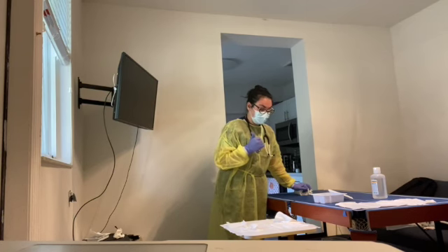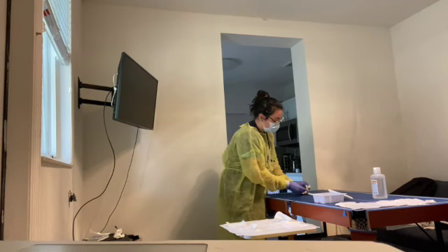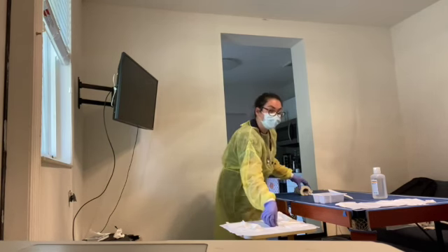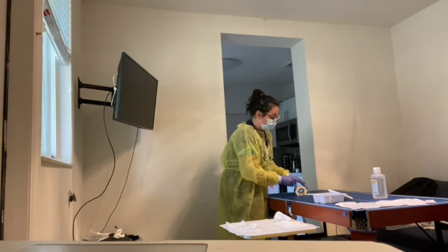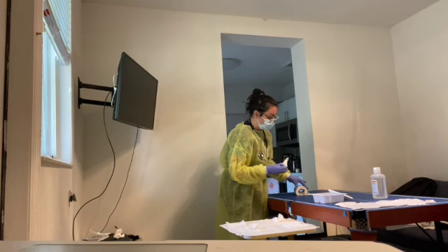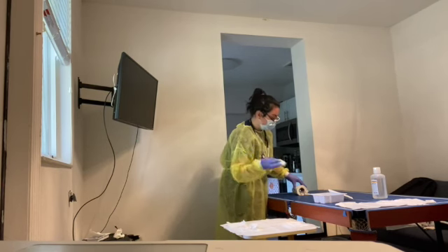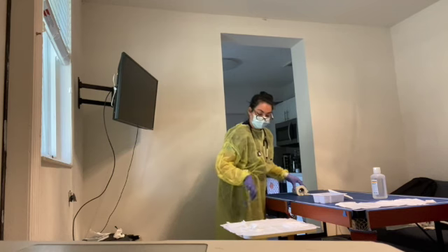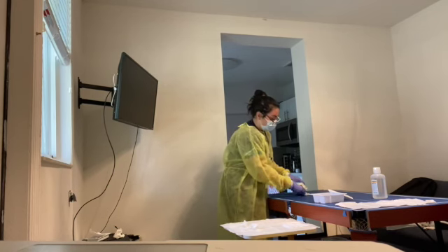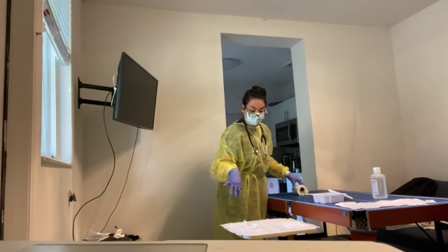So then, at this time, I'm going to grab one of the Q-tips and start cleaning under the patient. Okay, and then I'm going to dispose of it, and I'm going to take another Q-tip and start cleaning over the patient, and I'm going to dispose of it. Then I'm going to get one of my wet gauze, and I'm going to clean under the patient, dispose, get another wet gauze, clean over the patient, dispose. Then I'm going to get a dry gauze, and I'm going to go under the patient again, making sure that there's no excess moisture that stays and lingers, and dispose.